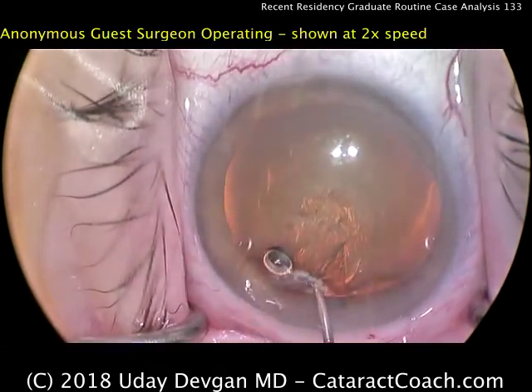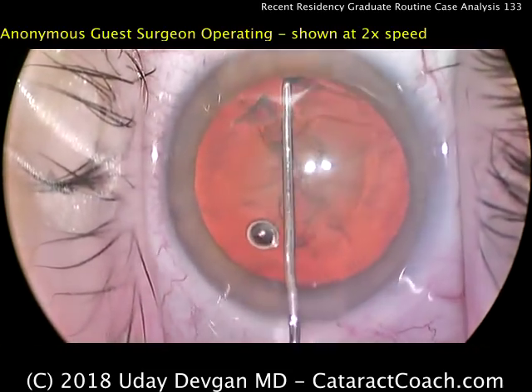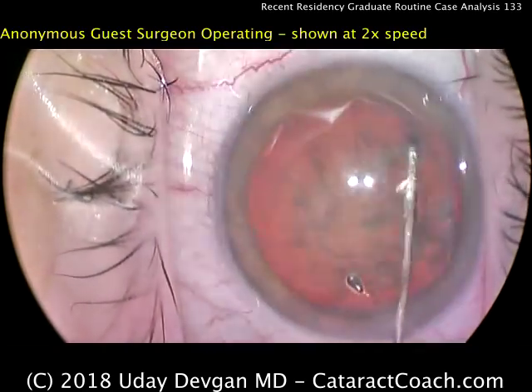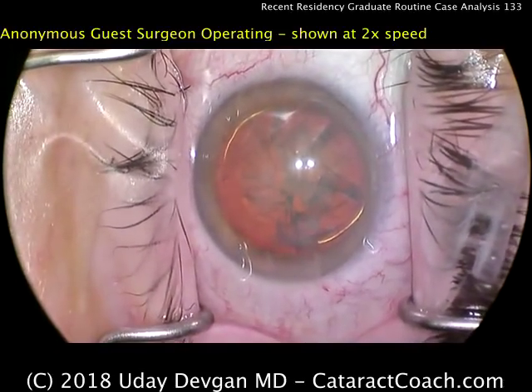Hydrodissection — a special cannula is being used here. This cannula can sometimes help reach the various angles around. There's a good rotation being done. Not my technique of hydrodissection, but certainly effective. There's also a little golden ring of hydrodelineation as well.